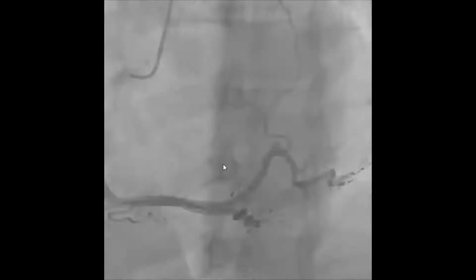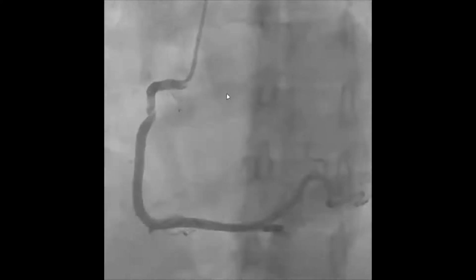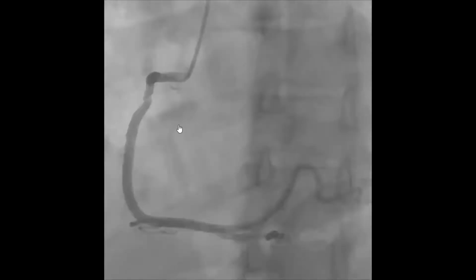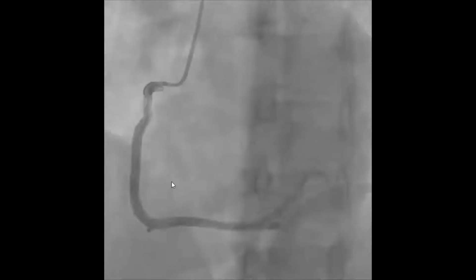So at a slower pace, you see some other movement. You see the respiratory movement. You see the rib cage and the lung structures moving up and down. You see those? Just look at it again. There's slower movement, respiratory movement here on this side. Just look at it.